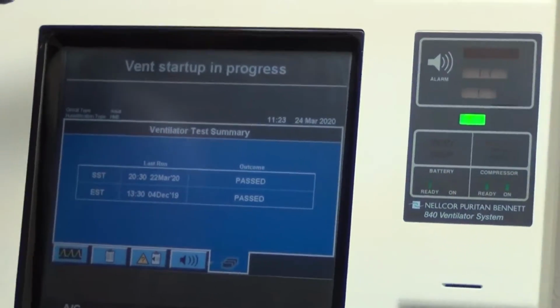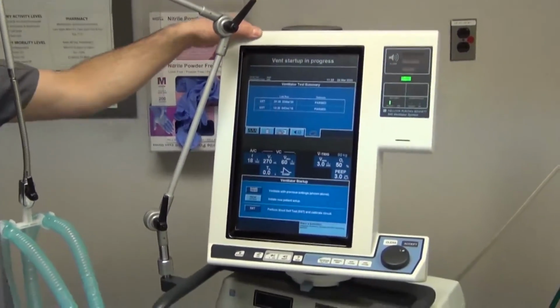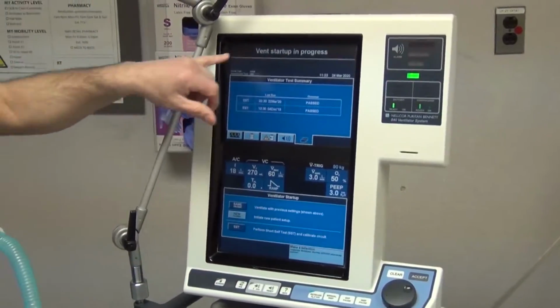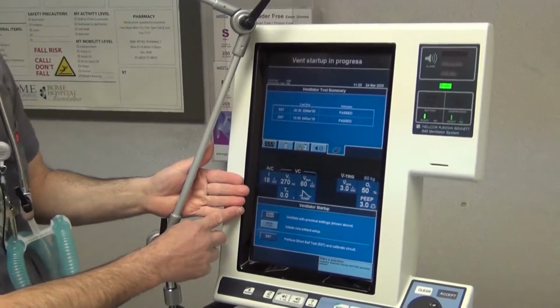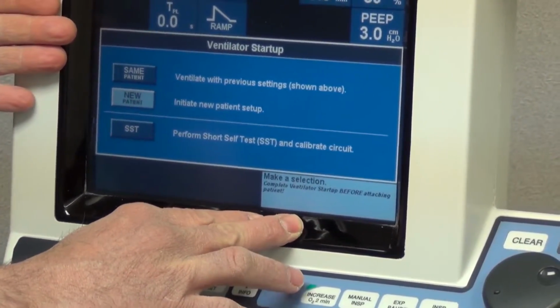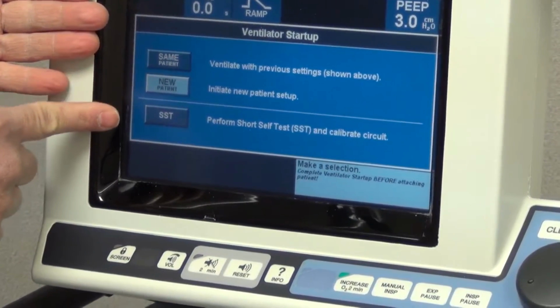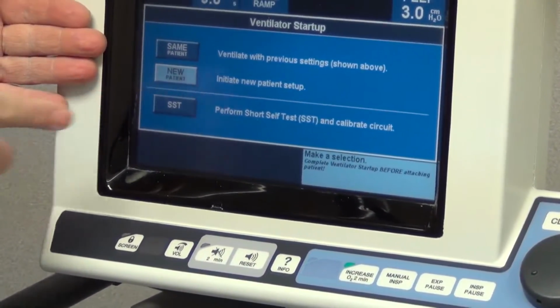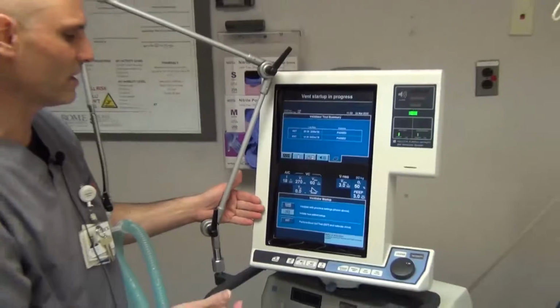Notice all these lights in all these locations are working. Those are important because those are your alarms and your notifications if there's any problems with the ventilator. This is the initial first screen that you will see when you start. It'll say ventilator startup in progress. And then down at the bottom of the screen, you'll see a notification box here on the right. And on the left, you'll see same patient, new patient, and SST. SST is just a test that the respiratory therapist does every time we take the patient off and on the ventilator.